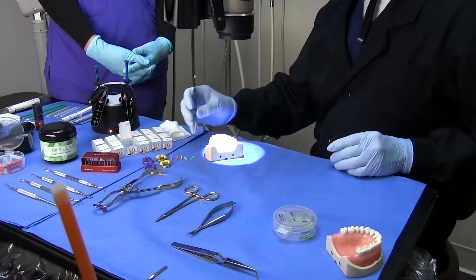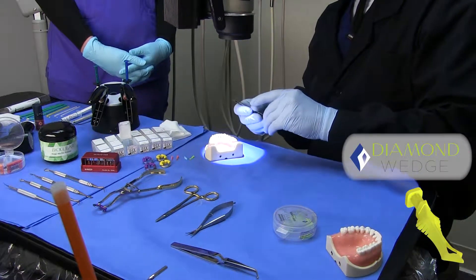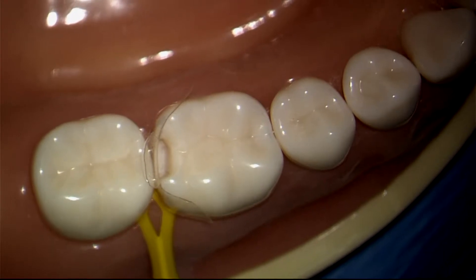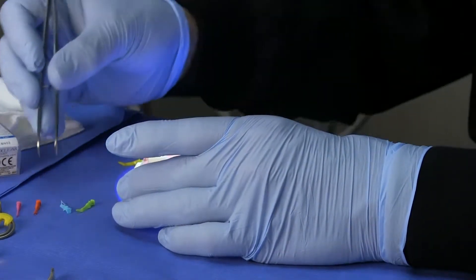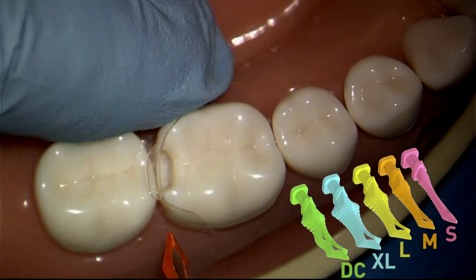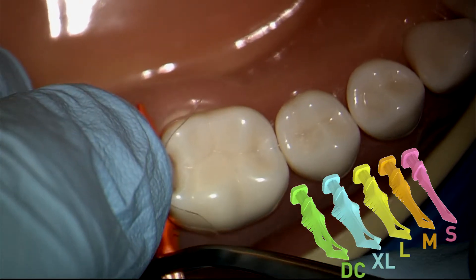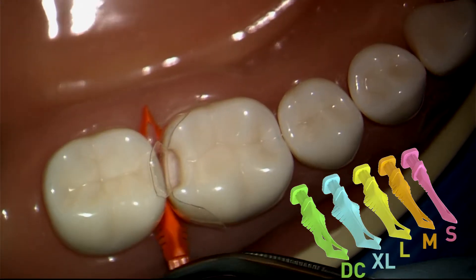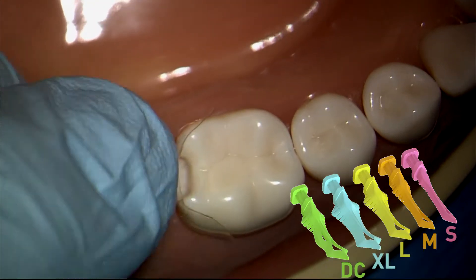My favorite wedge for most restorations is the large wedge. It looks a little bit too large for most areas, but because it collapses as you insert it, this is my go-to wedge. I'll start with the medium wedge and you're going to see that it slides in a little bit too easily. I'm going to hold the matrix down with this finger so that it doesn't slide — this is not doing a lot of work, so don't be lazy — let's move to the large wedge.